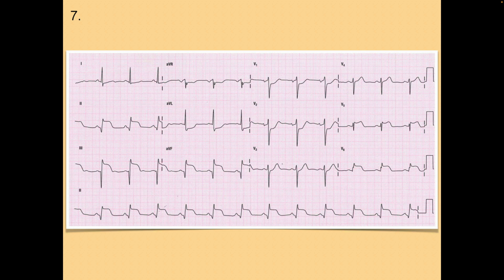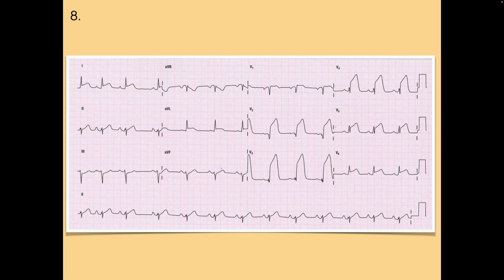Go through all the leads. And if you have them on paper, which you should, what I usually do is I label them with an E or a D for that particular lead. So for now, it's fine because I'm just having you practice a little bit, but again, it's better to be a little more systematic than this particular exercise is guiding you to be. Okay, that being said, number 8, please.